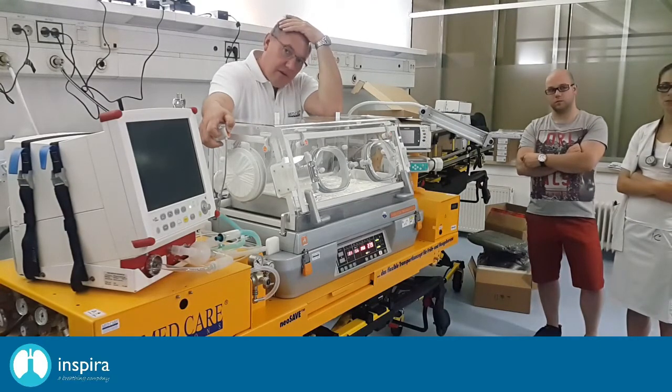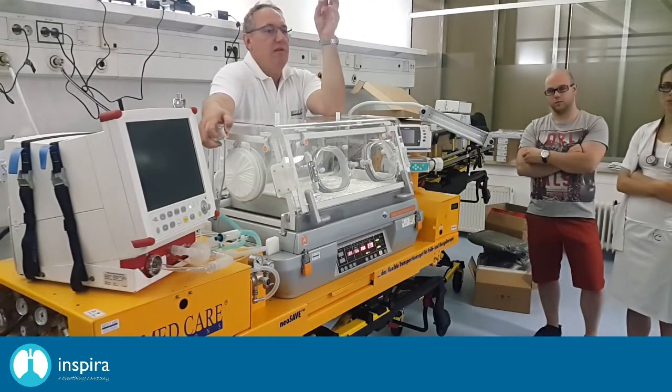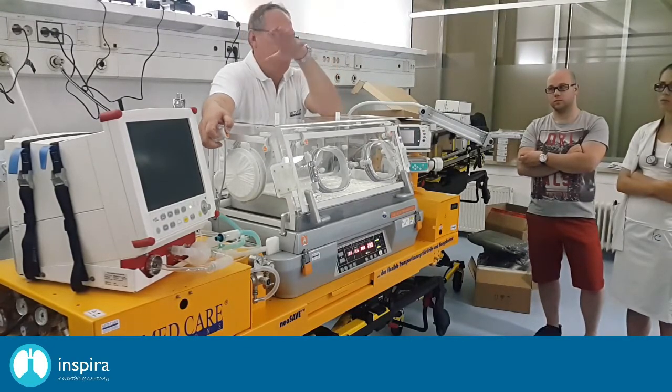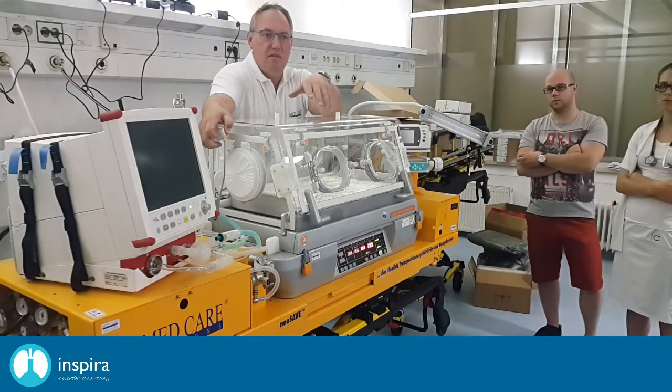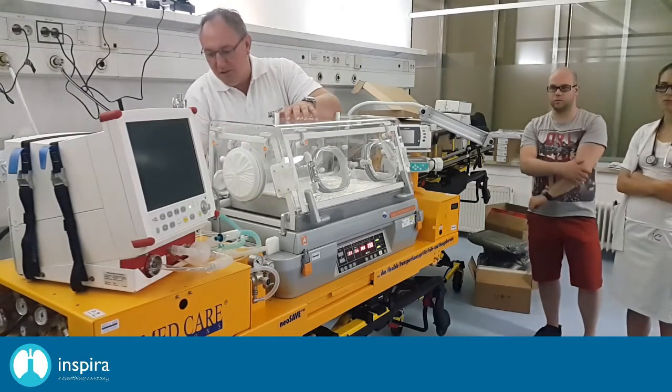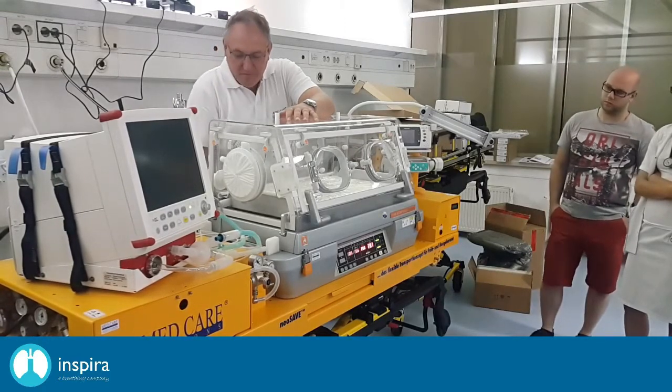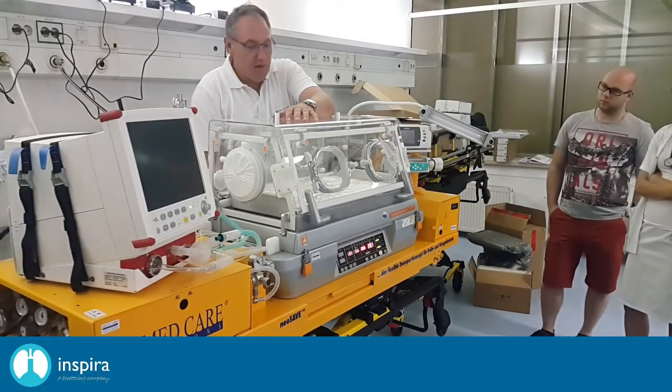Yes, absolutely. But if you want to do that, so if you want to have a gas mixture inside, you have to use the ventilator for this purpose. Is it done? Is it done there? Yes. Oh, thank you. My fingers. Okay. Any questions up to here?